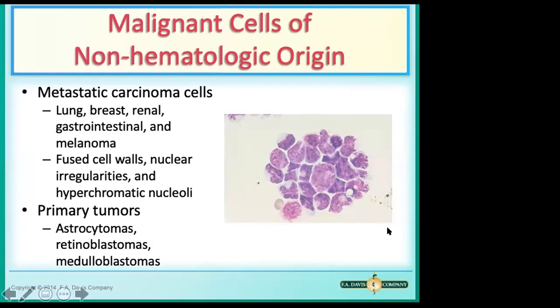Okay, so the morphology in CSF is something that we do need to perform as a part of the hematology department. A lot of times it's part of hematology, but sometimes it's part of chemistry. But in our hospital, it is a part of the hematology department for sure, right? Yeah, so this is really morphology. I'm not going to ask a lot of you when it comes to morphology here, except for you just knowing what's normal and what's abnormal. And then we'll get into the morphology more when we get into our hematology courses.